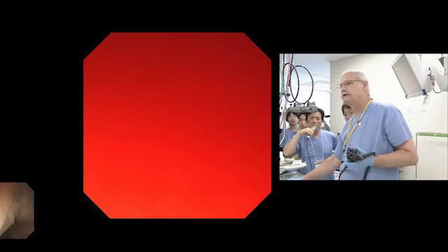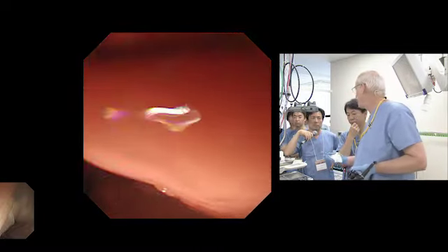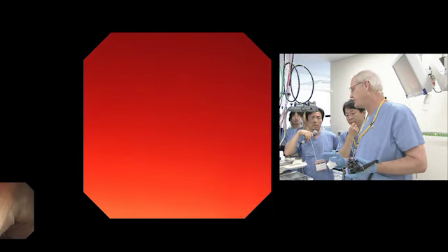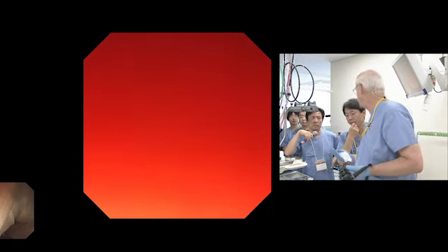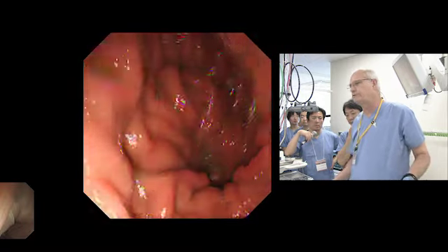Rob, what kind of echo endoscope do you use now? So for me, for the pancreas, always the linear. Even if FNA is not a possibility, for me, the best imaging is now with a linear. So this would be the instrument of choice.